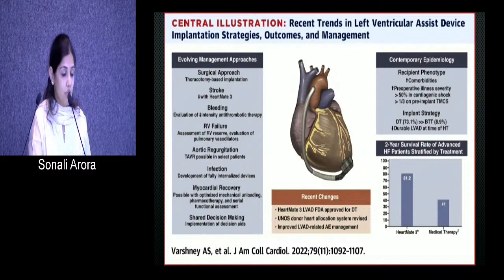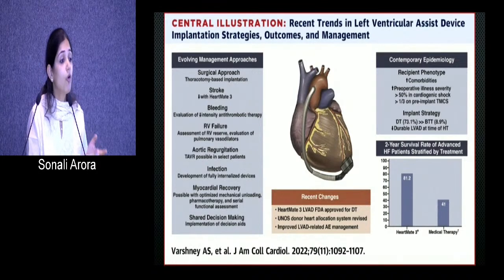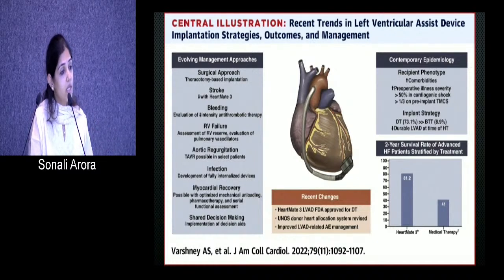Many of these patients, if they are on guideline-directed medical therapies with LVAD and the medications are on protocol, as per many recovery protocols that exist in the world, actually have the LVAD explanted and do well. I personally have at least 3 or 4 patients who had an LVAD that was explanted after 2 years, and they are doing well.